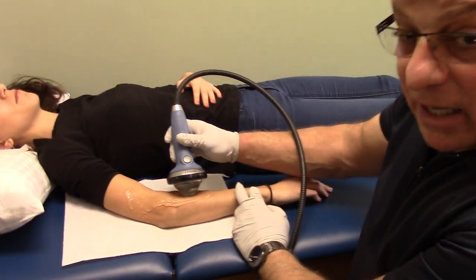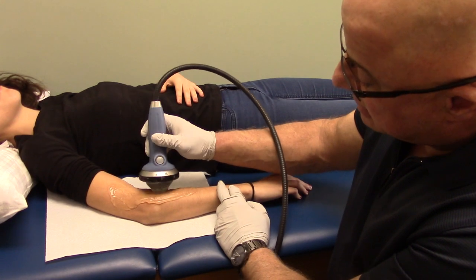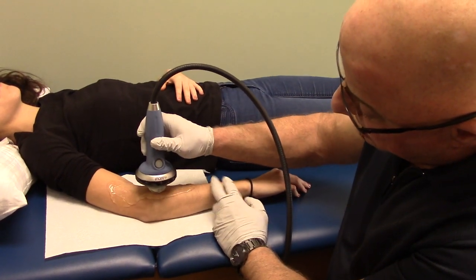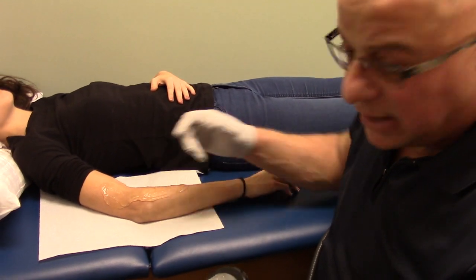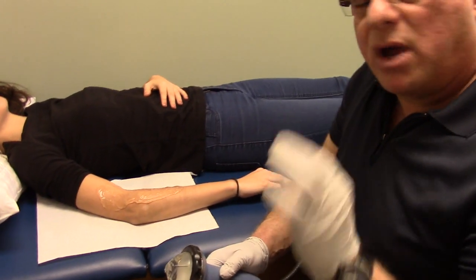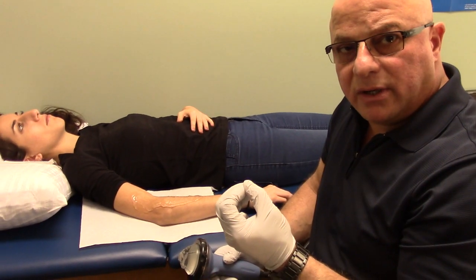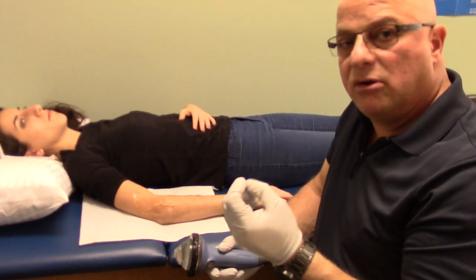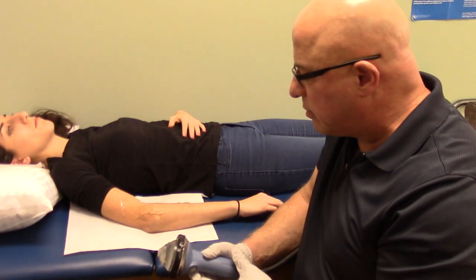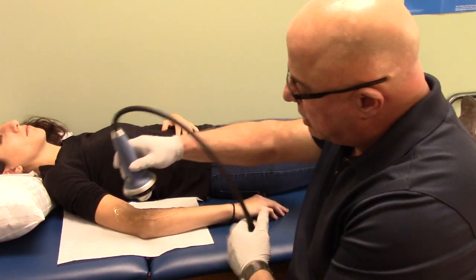By utilizing sound pulses only — no electricity, nothing — as we do that, we're irritating the periosteum, which is the sheet covering the bone and where the tendon attaches. Because we're creating microtraumas, it also causes new blood supply going in there. One of the things shockwave does is create neovascularization — new blood supply formation — which leads to a faster healing process and recovering from the condition.